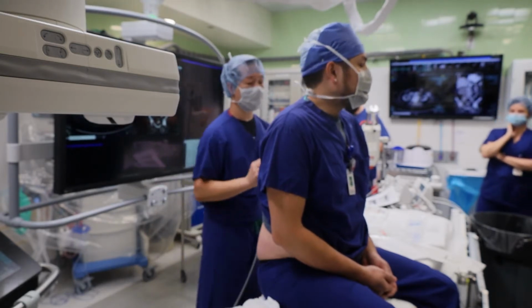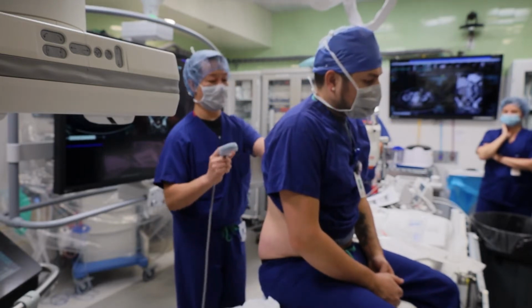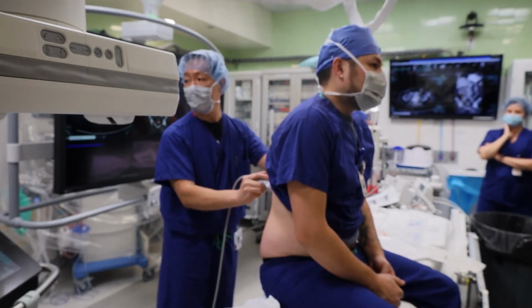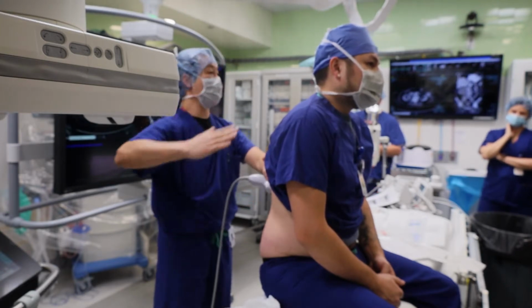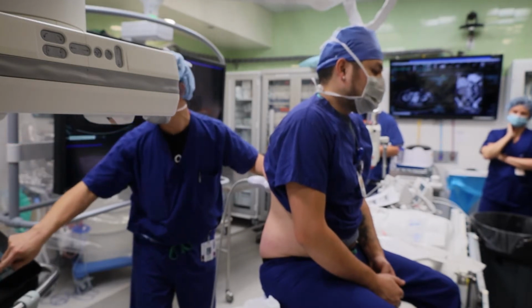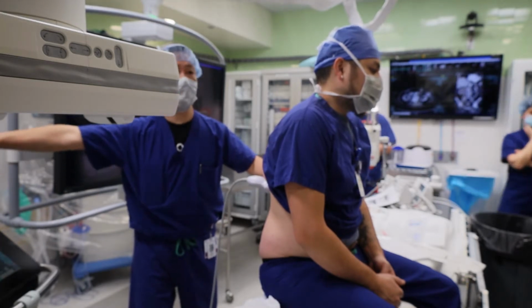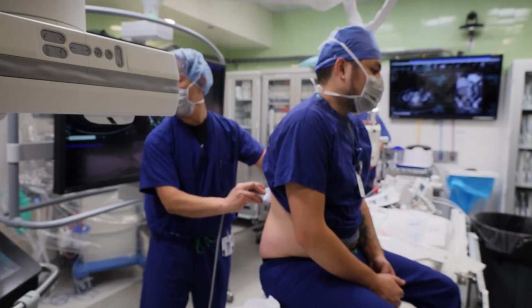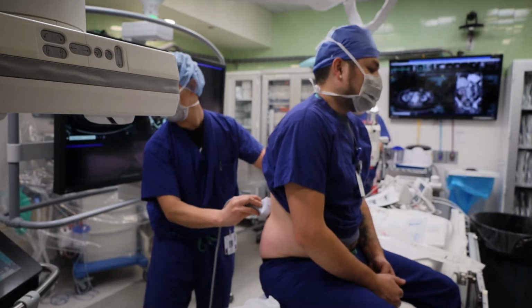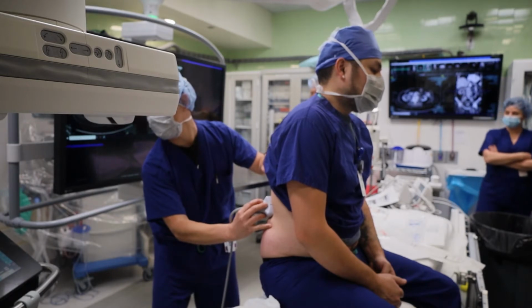Okay, so now we're going to ultrasound him. The right kidney is always lower than the left kidney because of the liver. When I put this on the back, I'm putting it at an angle to his ribs because the ribs kind of come down like a Christmas tree. And so when I'm scanning, I'm going to make this all brighter. That is actually liver, and this is all bowel. So I'm going to scan a little bit lower, and you kind of have to look around, and that is his right kidney.